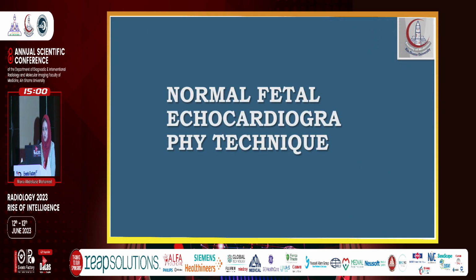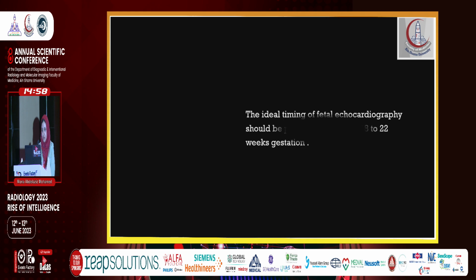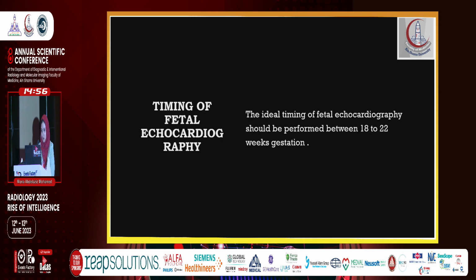We'll start with the normal fetal echocardiography technique and its proper timing. The proper timing for the fetal echocardiography to be performed is between 18 to 22 weeks gestation.